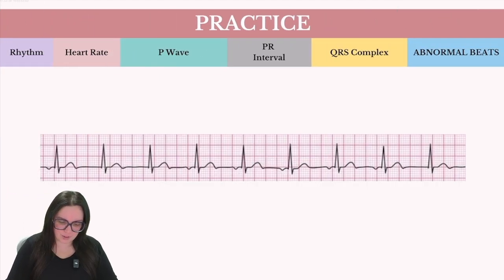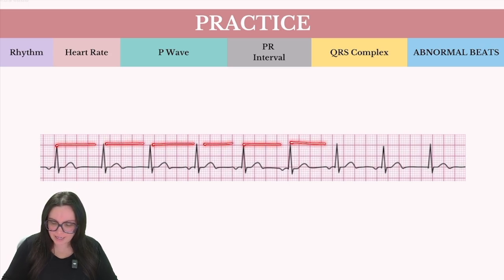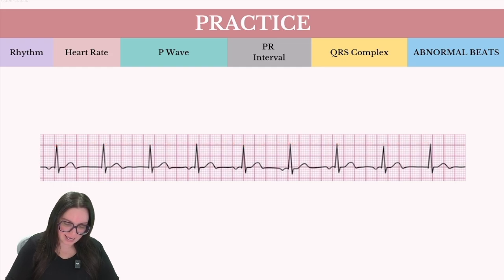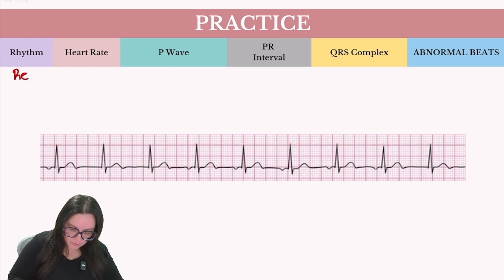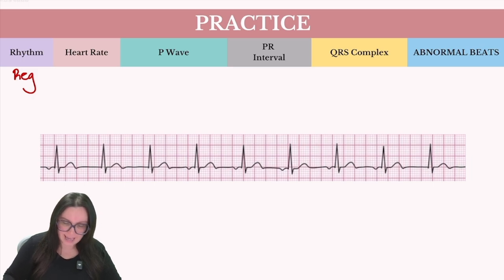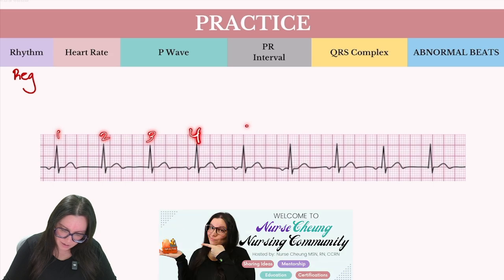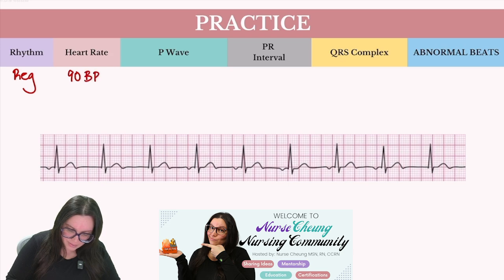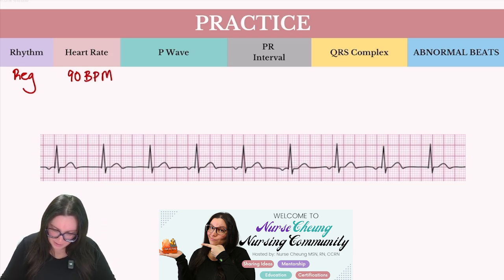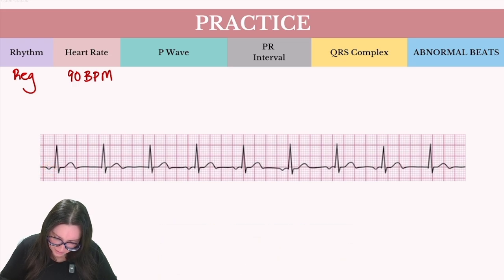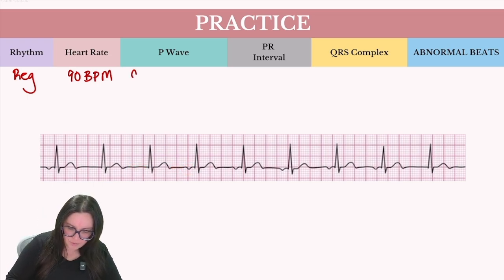Let's take a look at our next practice example. Again, we start with rhythm — do we have a regular or irregular rhythm? Based on what I can see, everything is falling in the exact same place when measured, so we would call this rhythm regular. Next, we want to count our QRS complexes — I have approximately nine, giving us about 90 beats per minute. Then I want to take a look at my P waves. It looks like I actually have maybe a little bit of an inversion here, then no P wave, and then another inversion. So the P waves are variable — we have both absent and inverted P waves.